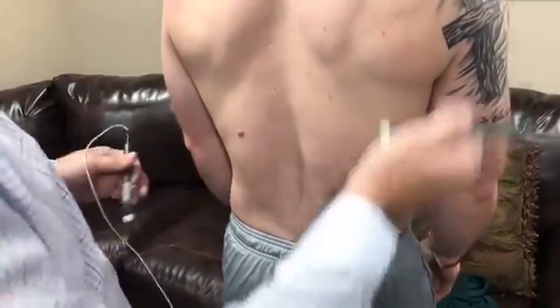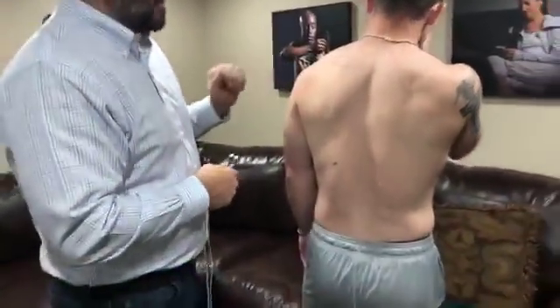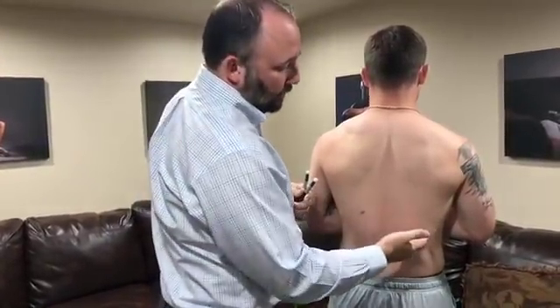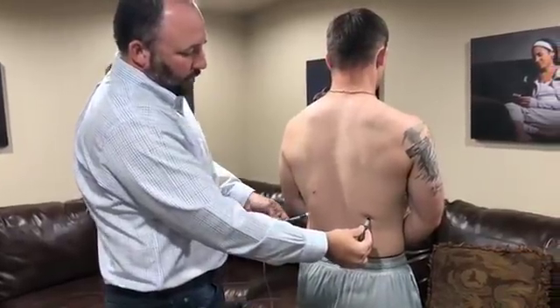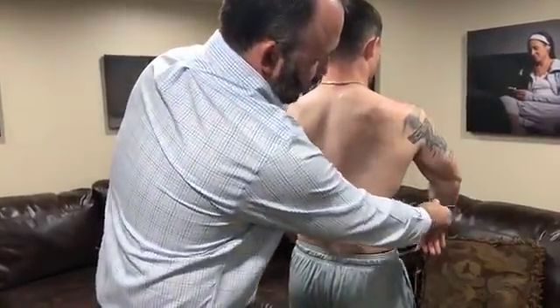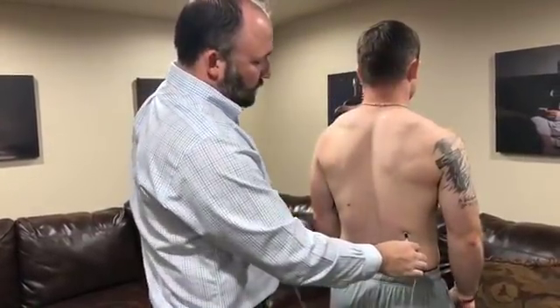We did our large X across the entire back, treated our Xs through the pain above it and below it, and then went laterally above and below. We would have asked Travis his pain zero to 10 when we started — let's say he was an 8 out of 10. We've done our protocol and he's down to a 4, so he had pretty good relief. Now we ask him to indicate with one finger his worst area of pain. We put one probe there and leave it stationary, and move the other probe all the way around his abdomen — 10 seconds at a time, going all the way around the body, treating right through there to get a nice fan through his worst indicated pain.